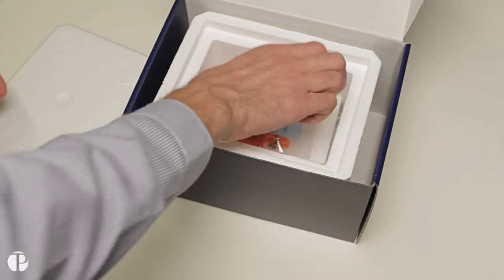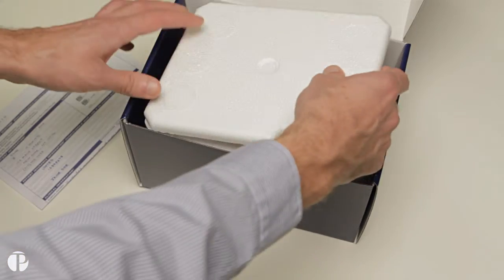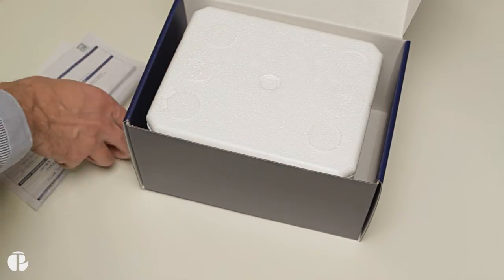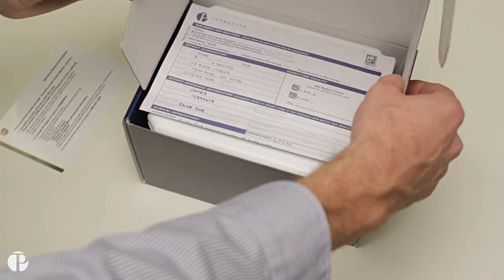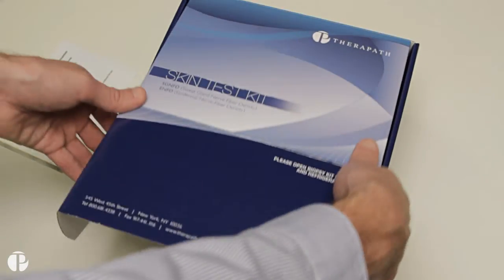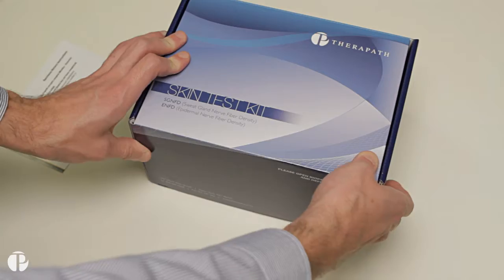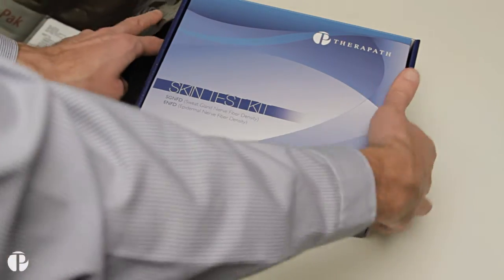Place the biohazard bag containing the sample vials on top of the barrier and cover the cooler. Place the cooler inside the kit box. Add the completed requisition form and any additional paperwork on top of the cooler. Close and secure the box and place it inside the pre-labeled shipping pack.